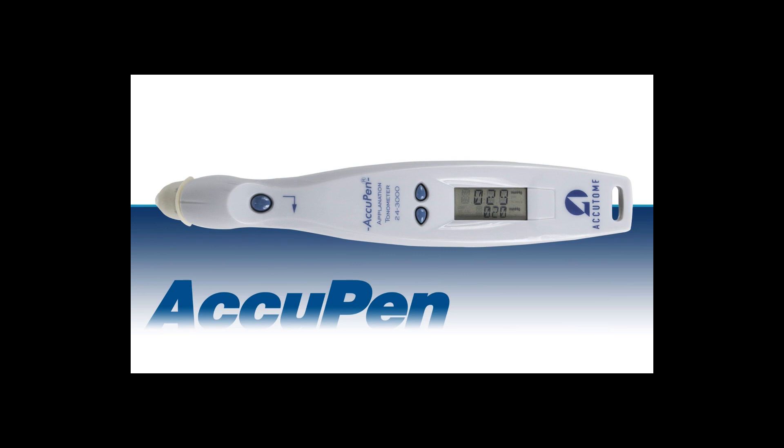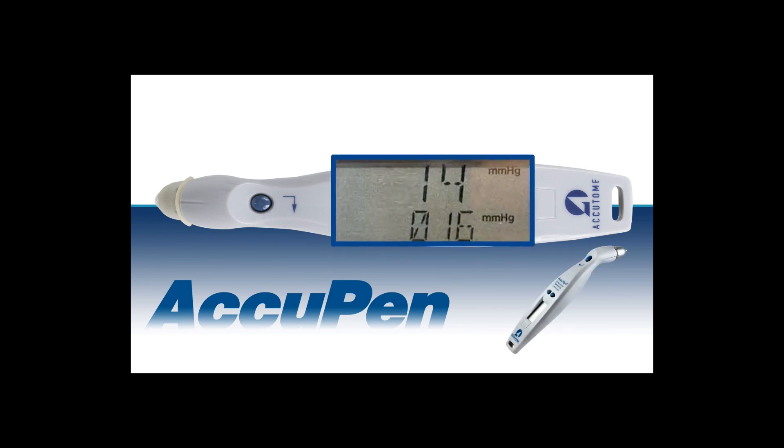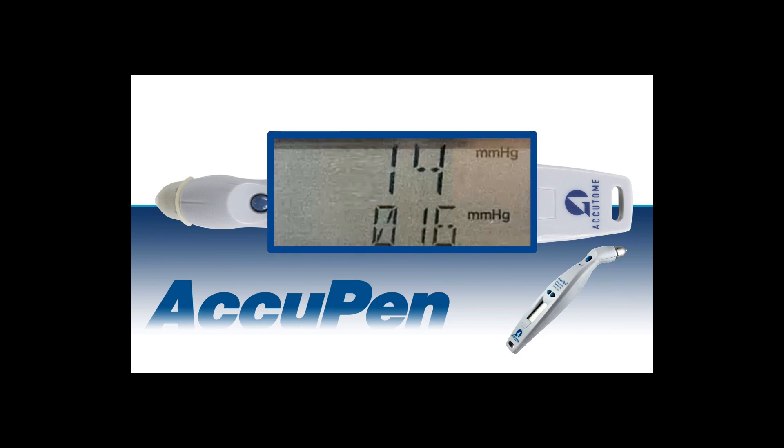The longer chirp indicates you have obtained an IOP measurement. The number of short chirps can vary, but typically three to five chirps will produce one measurement.